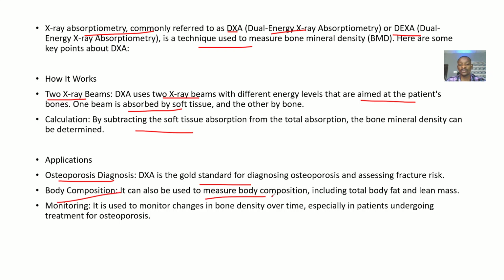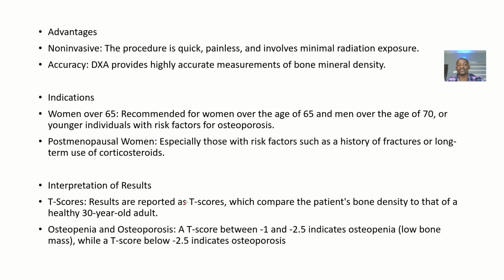Then body composition. It is used to measure the body composition, including the total body fat and lean mass. Monitoring: it is used to monitor changes in bone density over time, especially in patients that are undergoing treatment for osteoporosis. We're trying to see how the patient is responding to treatment.